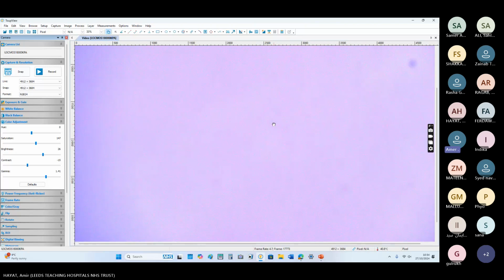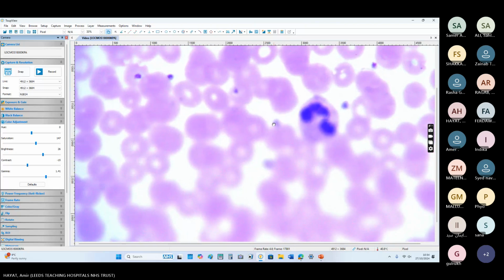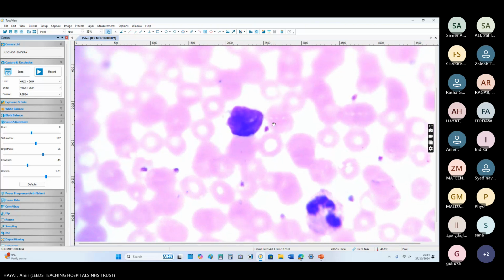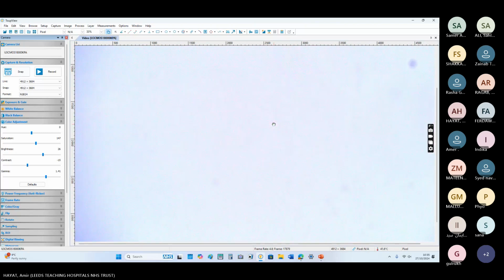If you are working in NHS, your laboratory must have a Sézary syndrome collection. They should help you with that, but do see them before the exam because they always come in the exam. All right.